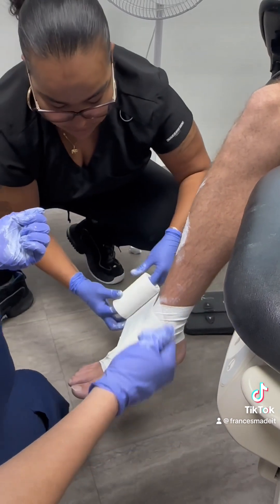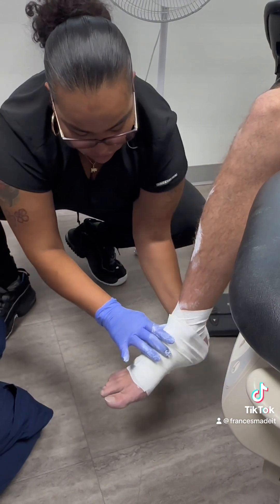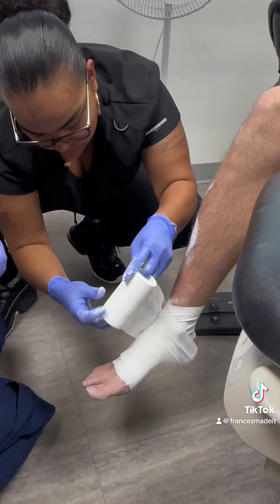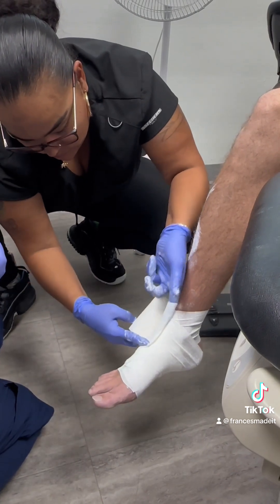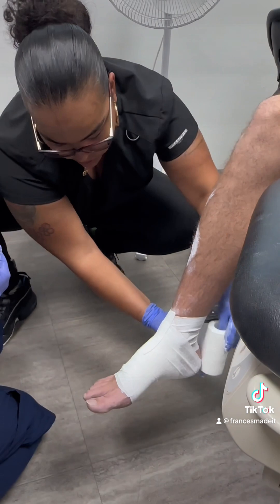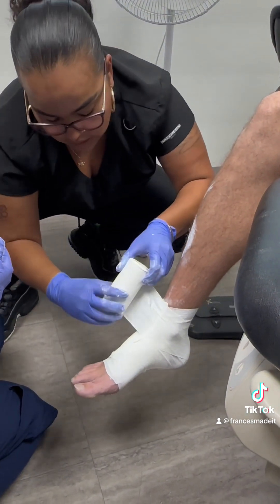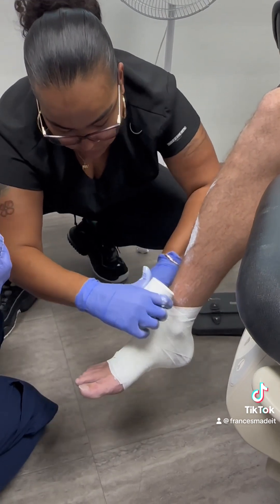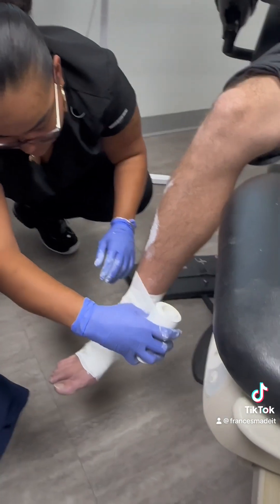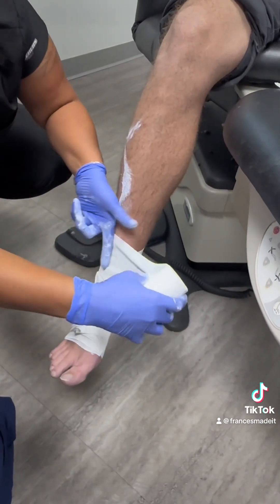It's an awkward position here because this bed doesn't come all the way up. Go around your ankle and work it around nice and neat. I like to see about 25% coverage on the foot itself, and then as you work your way up, 50% coverage — you see 50% coverage.